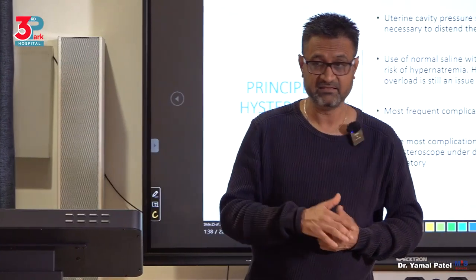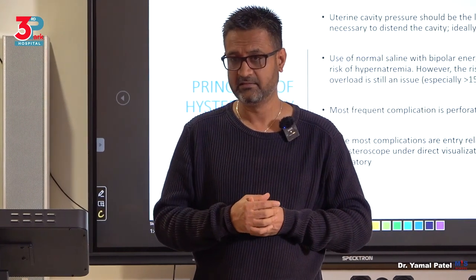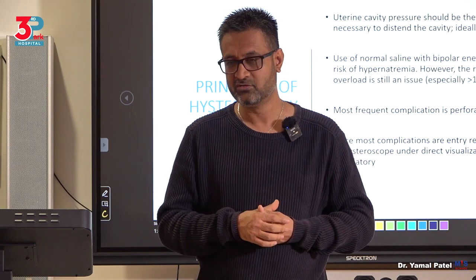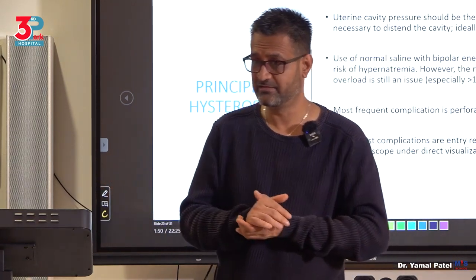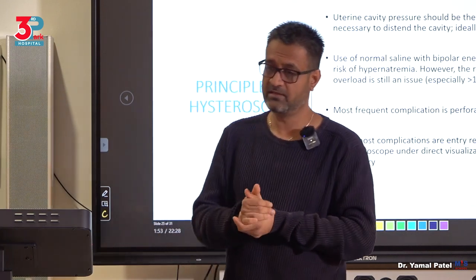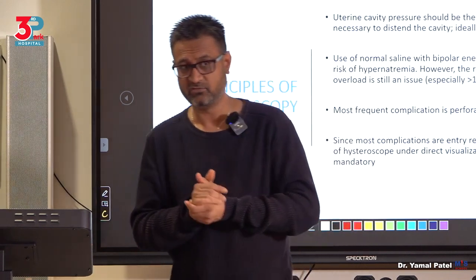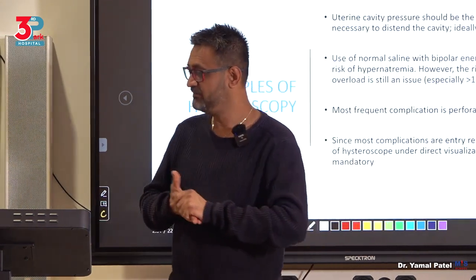Again, that's another demonstration I normally give, the actual settings. Hysteroscopy, you need to know the settings, and there is no alternative to it. There is no shortcut to it. You should know how to play with the fluid and the settings so that you are always safe. So the uterine cavity pressure.